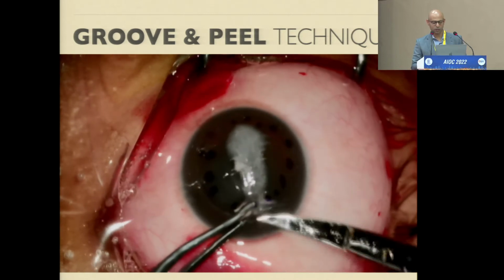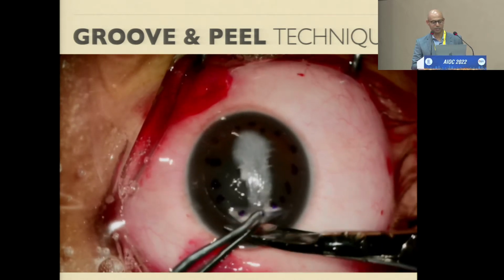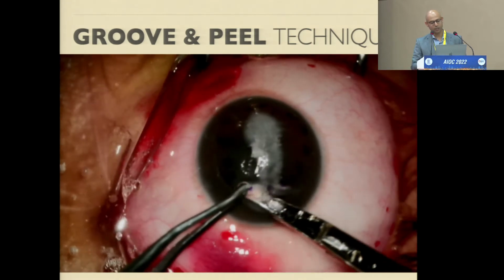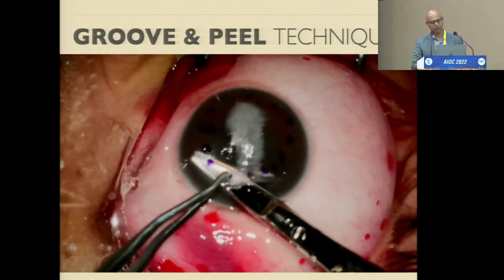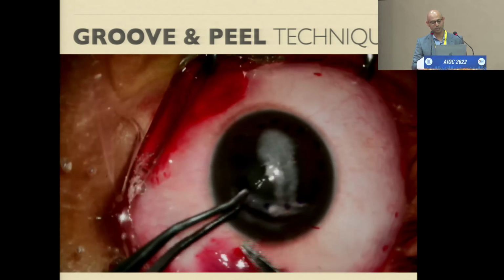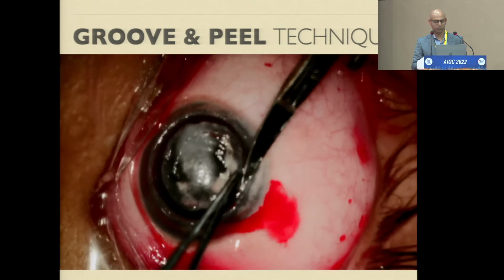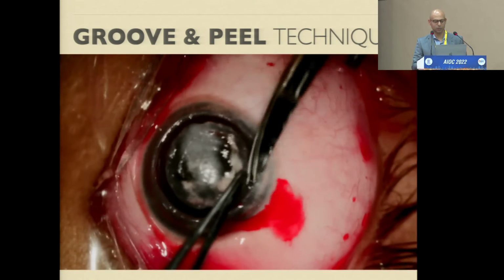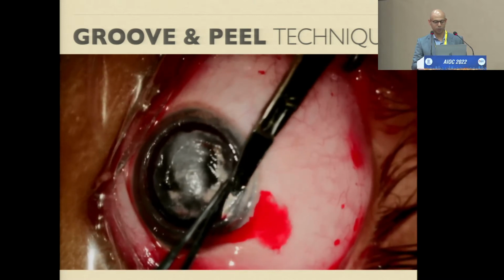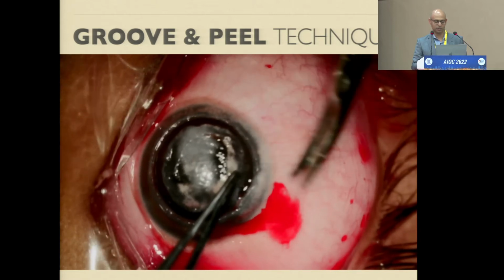So we use a scissor like this. Here I am using a universal corneal scissor, which we use for ECC, but now I use a separate scissor. Basically you create a little groove underneath your partial thickness trephination with the scissor. You're doing a scissor dissection all around, and after you've completed a 360-degree round, you go at a deeper plane. Basically you keep spiraling deeper with each dissection. You go in closed and open the scissor under, and then you cut the tissue that has been dissected.